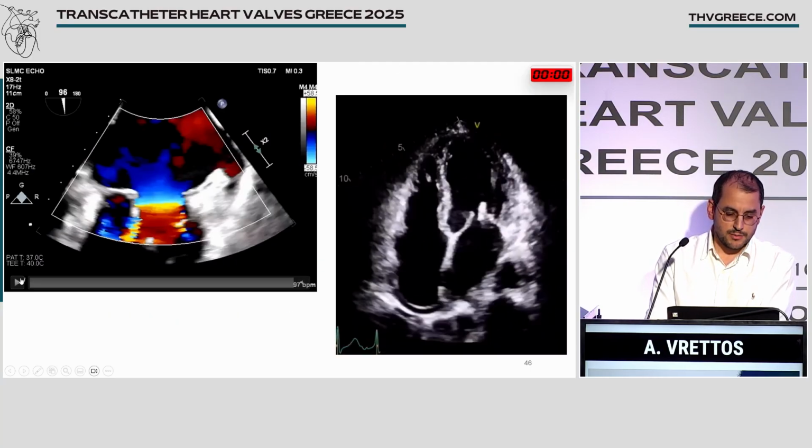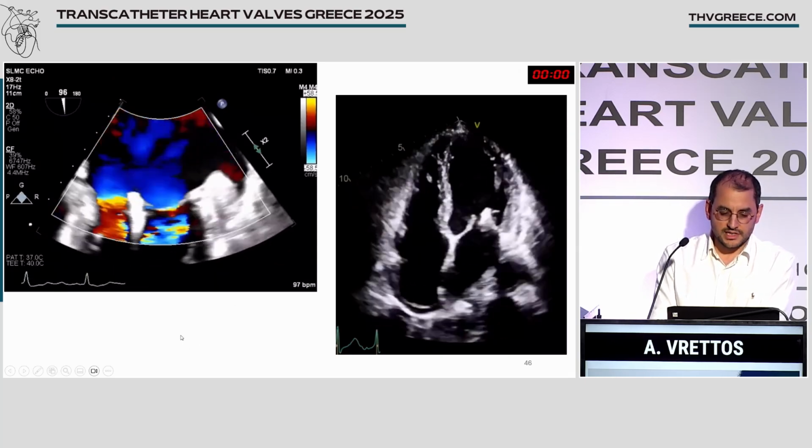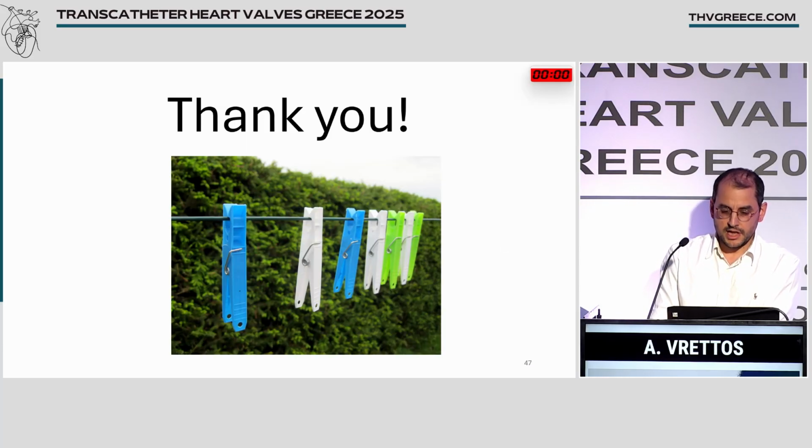And here you see probably a less good outcome. However, it's still probably acceptable. On the right side is a picture no one wants ever to see. That's a detached clip. Thank you.